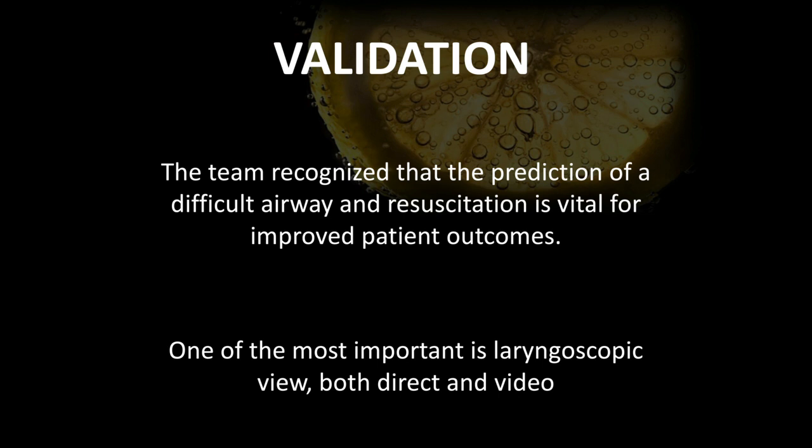And so you have only still done one attempt, but you've moved from video to DL based on what you're seeing. And again, it comes back to the HEAVEN criteria. Hopefully, based on your assessment using that tool, you've evaluated, hey, I probably have secretions. And that's where you would use the SALAD technique. But ultimately, what it does is it prevents us from having too many attempts.